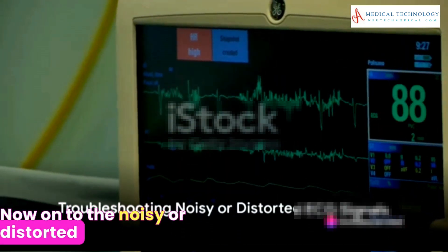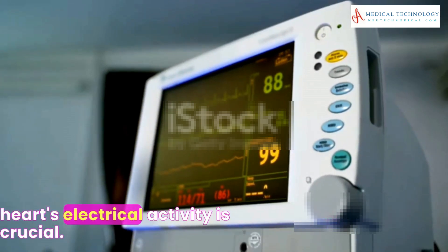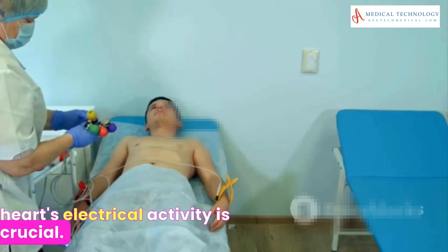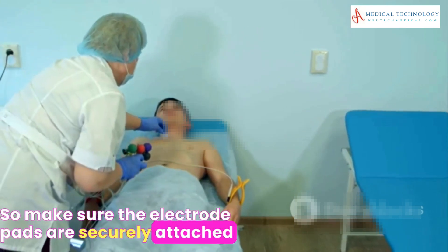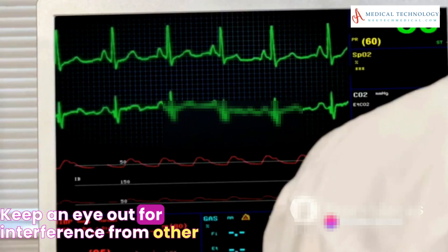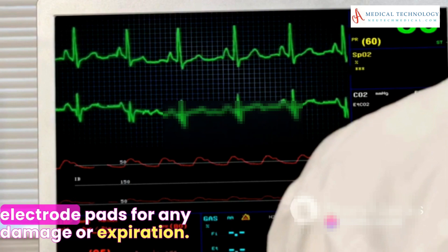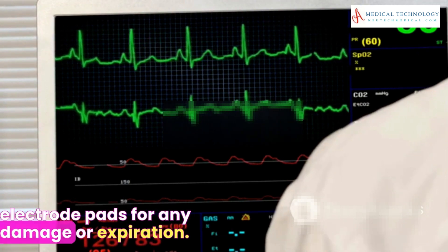Now on to the noisy or distorted ECG signal. This graphical representation of the heart's electrical activity is crucial. Make sure the electrode pads are securely attached to the patient's skin without air gaps or wrinkles. Keep an eye out for interference from other electronic devices, and always remember to check the electrode pads for any damage or expiration.